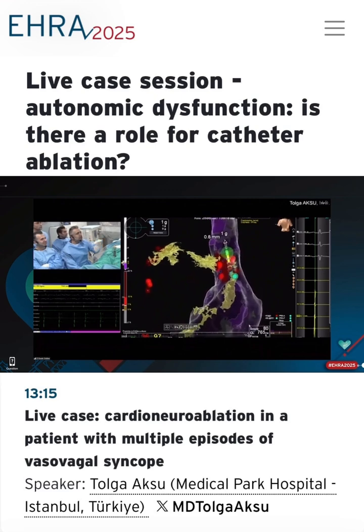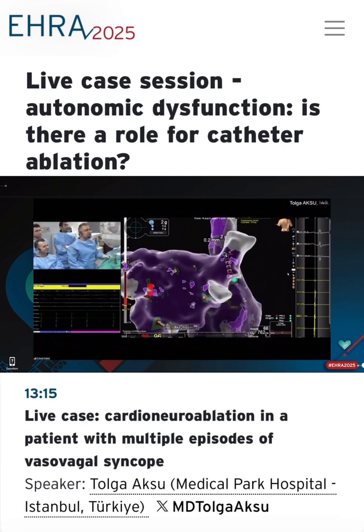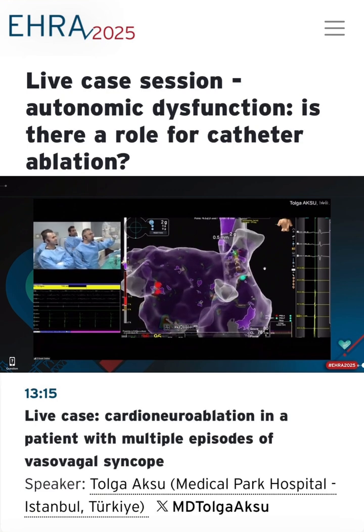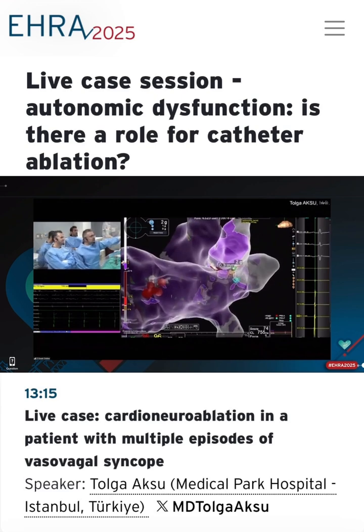Yes, and can you add the left atrial map? Okay, so remove the CT specimen. By the way, we used CT of the in-heart system for these 3D map images. These are perfect images. So can we see the left superior GP from the upper part of the left atrium? Yes. We combined CT, fractionation mapping and peak frequency, and we ablated this area for the left superior GP.